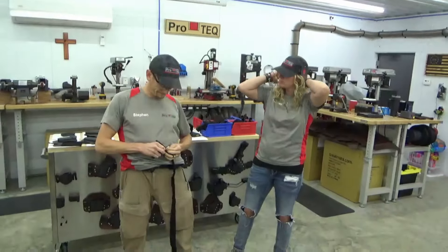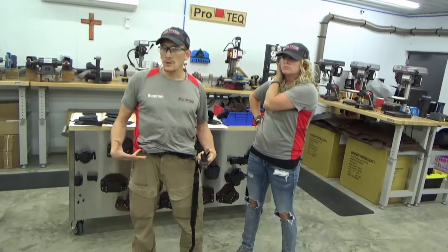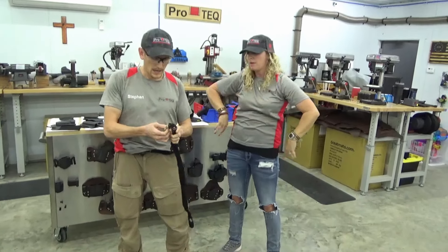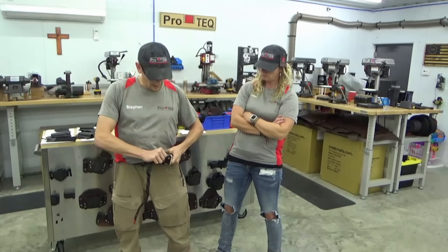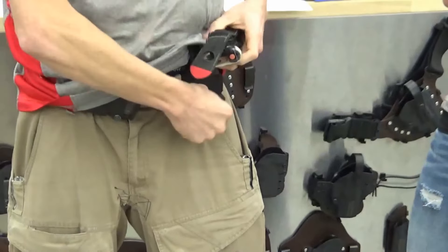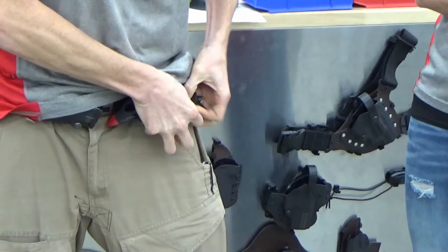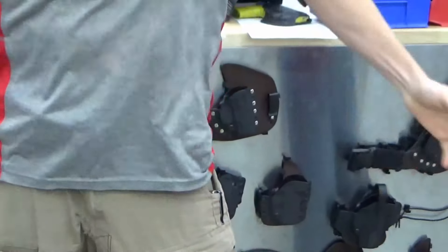So the low profile tourniquet holder is a way to wear a tourniquet on your belt, on your duty belt, on your kit using a molylock clip. And it's a very simplistic and comfortable, believe it or not, way to carry a tourniquet. Let me dress this one up really quick so I can show you. It goes on the belt right like this, and it's got a little tab underneath it. Here's what it looks like under the shirt.